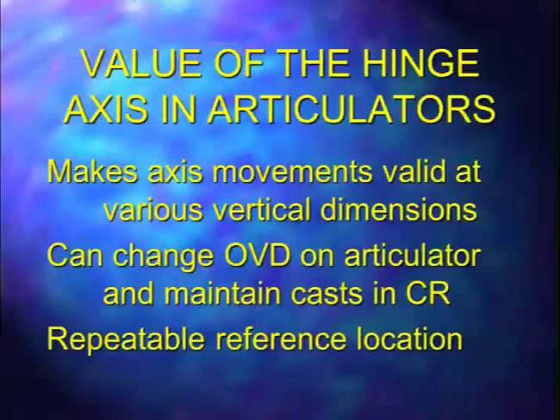Well, the value of the hinge axis in articulators is it makes axis movements valid at various vertical dimensions. You can also change the occlusal vertical dimension of occlusion on the articulator and maintain the cast in centric relation. It's also a repeatable reference location.